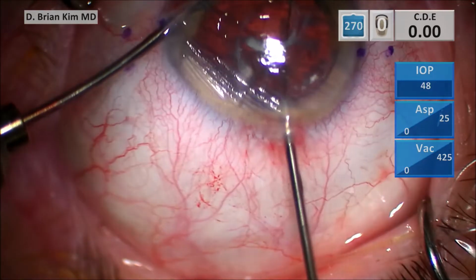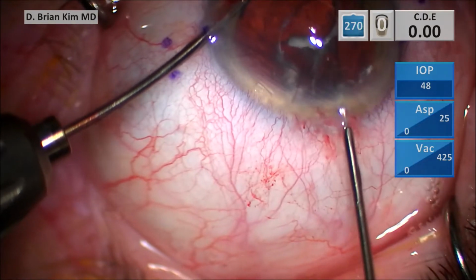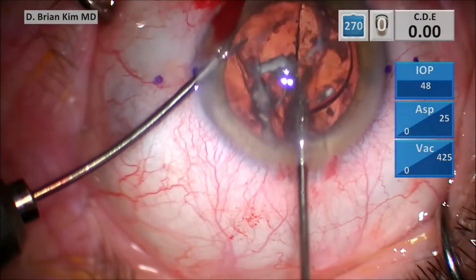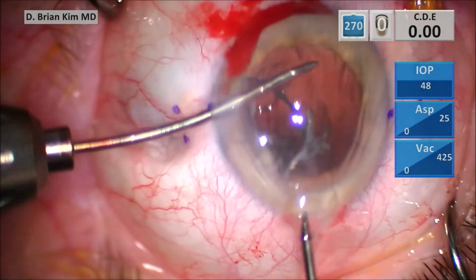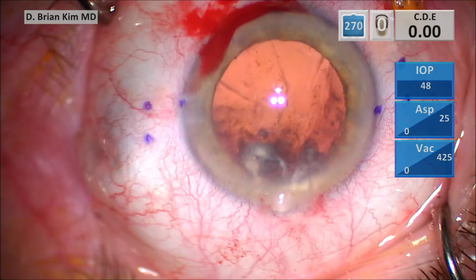Unfortunately, it's getting caught on the incision a little bit, so I push it with the teeth closed so I can access the optic edge a little bit easier, and then I grab it. Once I grab it, I shield the corneal endothelium with the microforceps, and the lens comes out.